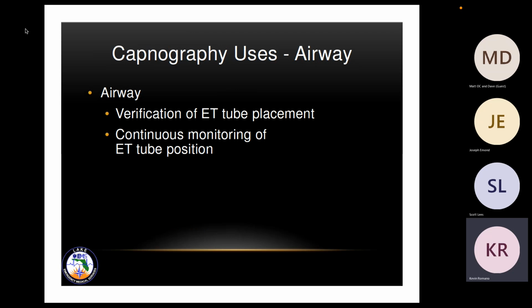Airway, it's a verification of ET tube placement. It's also a verification of King Airways, combi tubes. My God, I'm dating myself a little bit. King Airways, LMAs, iGels, any kind of supraglottic airway. It works with supraglottic and paraglottic, either one. Okay, it helps that tube verification. Also, continuous monitoring of ET tube positioning. So if you have a vented patient, you're taking on a transfer, they need to be on end-tidal, right? And just for future reference, if you have the Zoll monitors, Memorial's end-tidal is compatible with our monitors for Zolls.